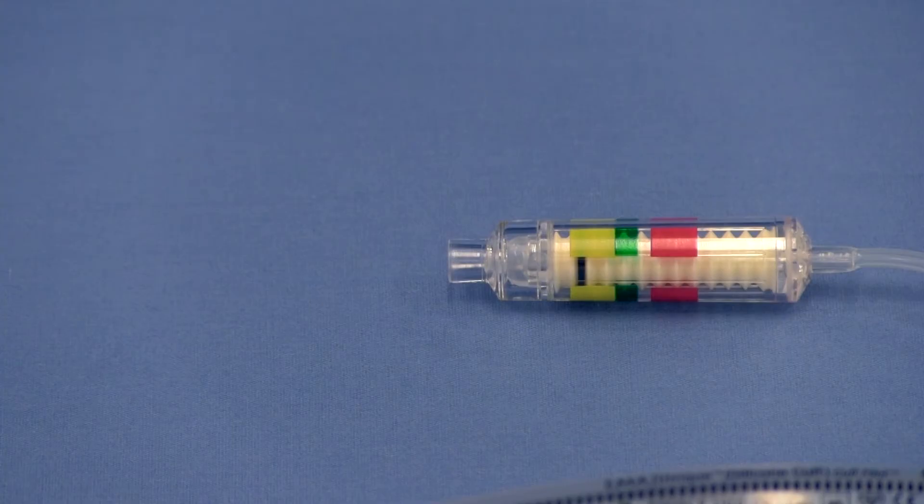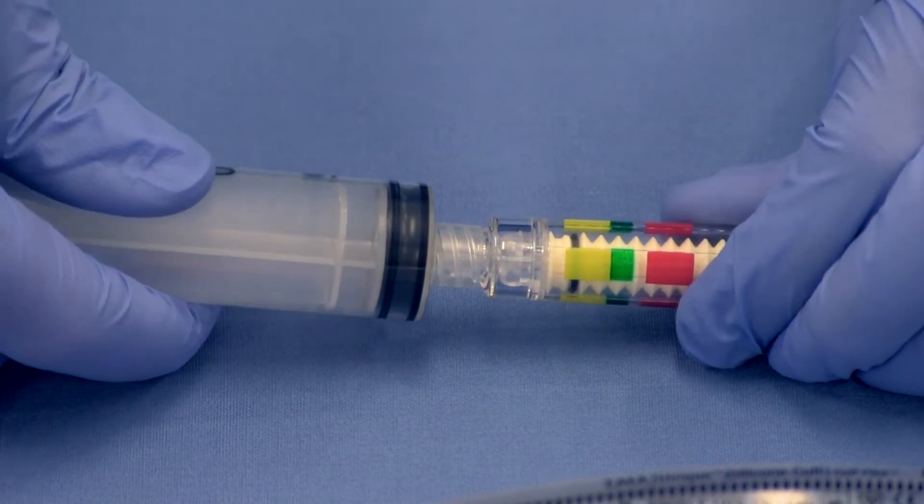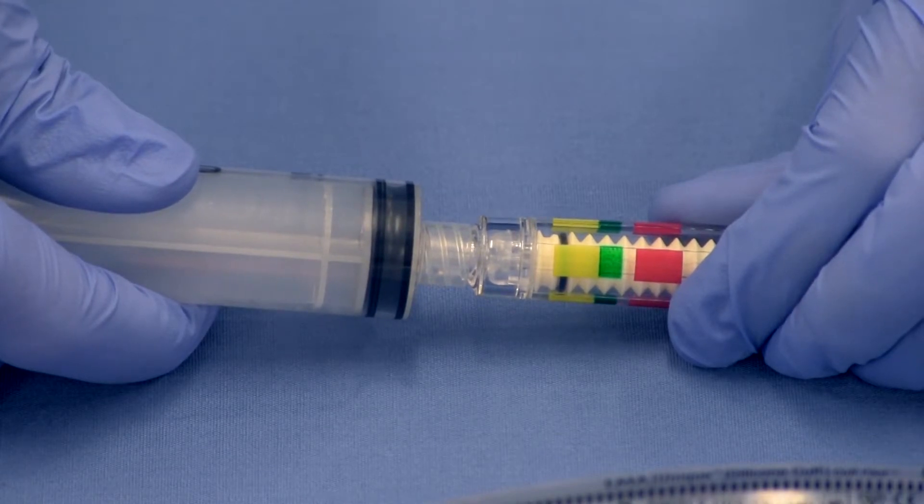When connecting the inflation syringe to the connector of the LMA cuff pilot valve, push and turn the syringe to ensure that the tip of the syringe is inserted far enough that it makes contact with the silicone valve within the cuff pilot valve.